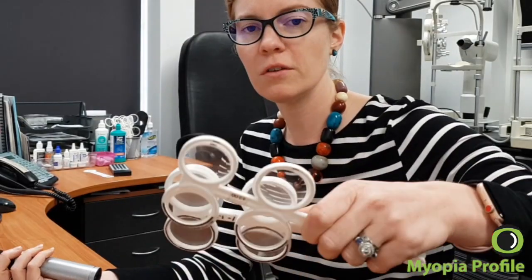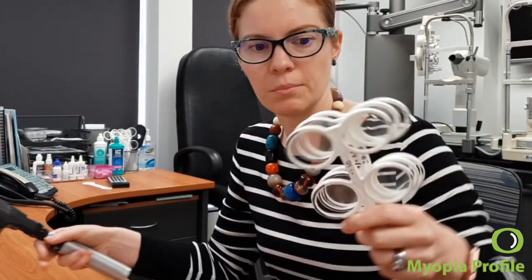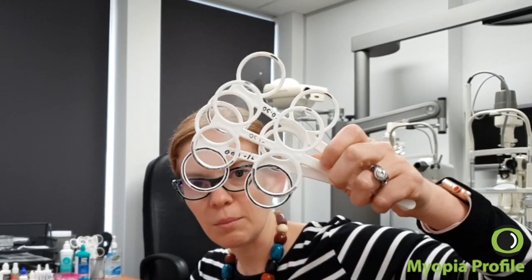When you're using the flippers, it's very easy to just slide them down over the top of the patient's eyes and then quickly flip. I quite often hold two or three flippers in my hand at once — four is a bit much for my small hands — but you can quickly flip between three flippers and get very quick measurements.